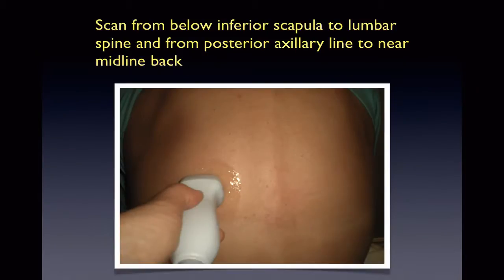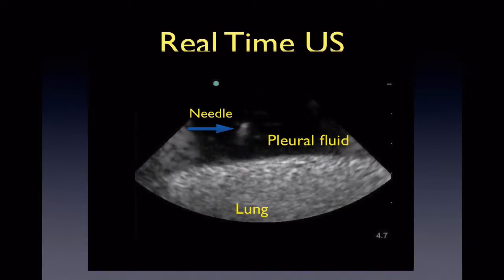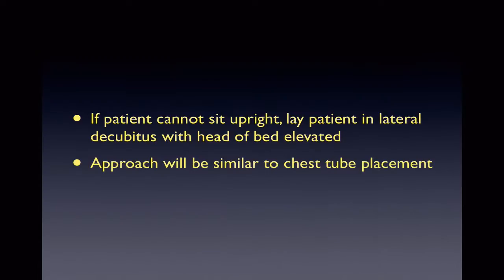Once positioned, scan from below the inferior scapula to the lumbar spine and from the posterior axillary line to near the midline back. Your indicator should be pointed to both your and the patient's left, as the indicator dot on the ultrasound screen should also be on the left. You want to scan until you visualize the largest pocket of fluid to tap, keeping in mind the respiratory cycle of the patient. Here is a real-time ultrasound showing the needle tip in the pleural fluid. If your patient is unable to sit up, you can do the procedure in lateral decubitus with the head of the bed slightly elevated so fluid can pool inferiorly — this approach will be similar to a chest tube placement, except you will use the thoracentesis kit.